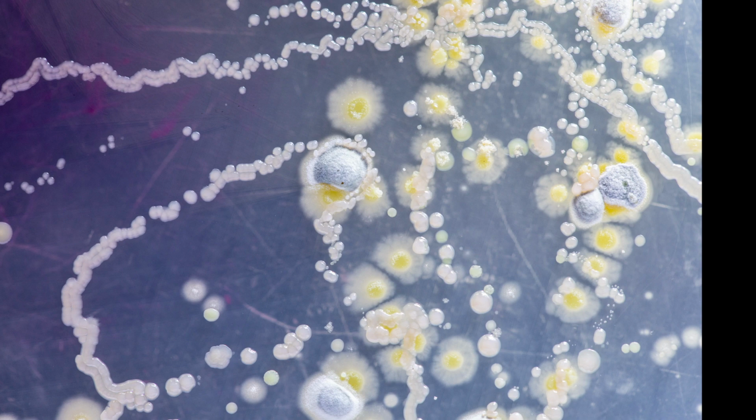So for Haemophilus influenzae, we discussed that zone edges might be fuzzy or accompanied with haze. That again, it's important to hold the plate about 30 centimeters from the eye. We recommend to hold it at a 45-degree angle to the workbench, which usually helps quite a lot to get rid of that haze or very, very light fuzzy growth.